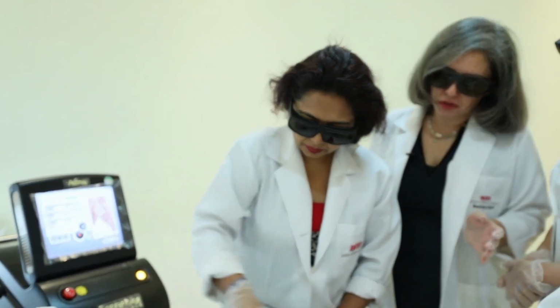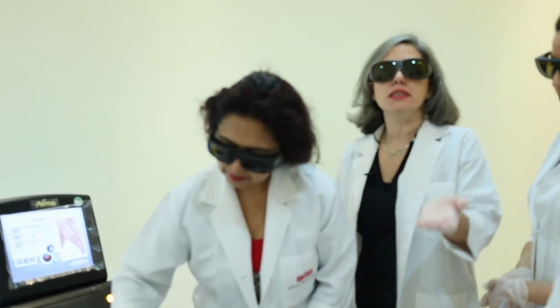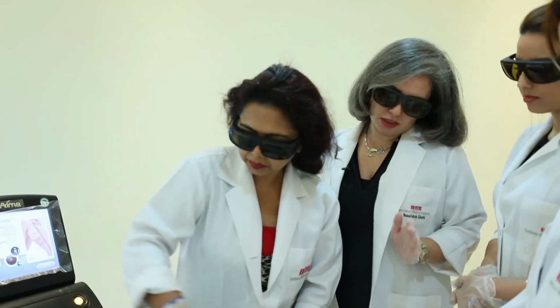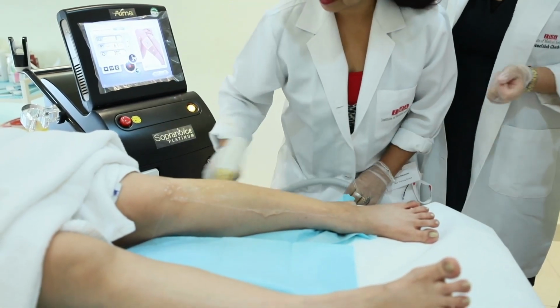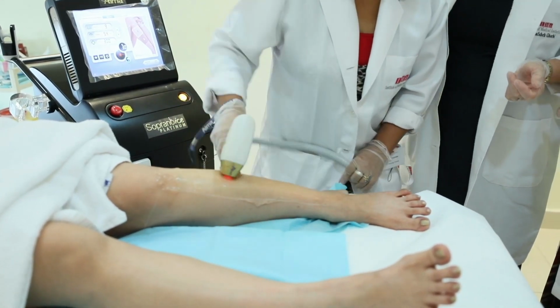Anytime in the middle of the treatment, if the patient expresses any discomfort, any body language, stop the laser right there. Check if the patient is fine, if any sensation is there, and then you can continue. Okay, it is not too much for you? Yeah, take a look at him. I'll hand it over. No, you can continue this grid.